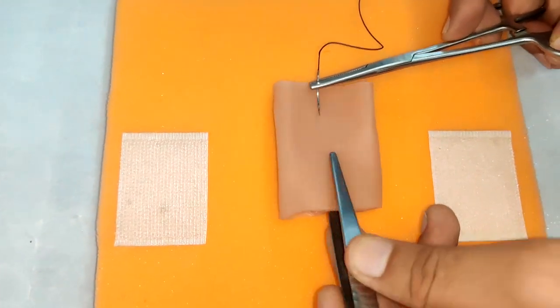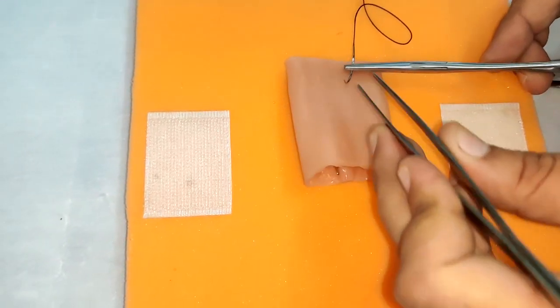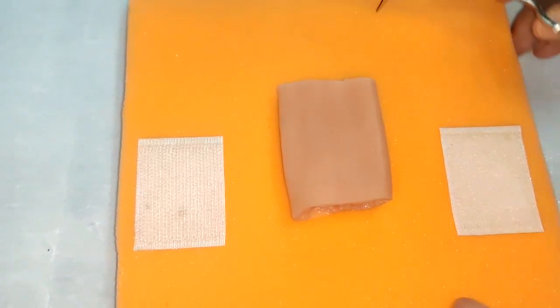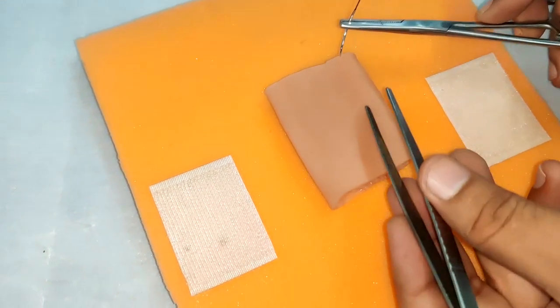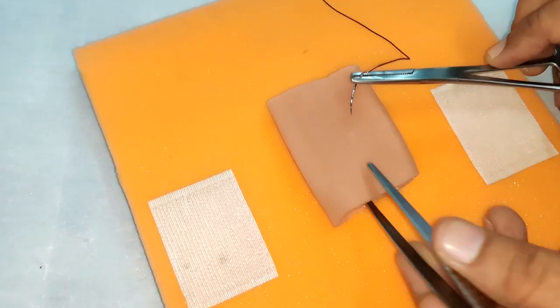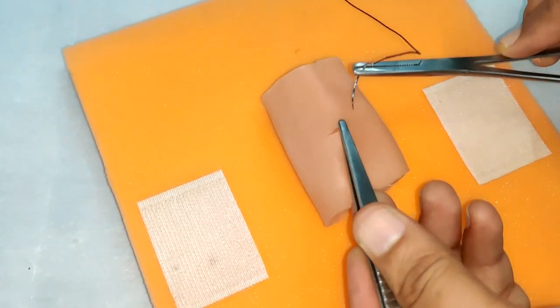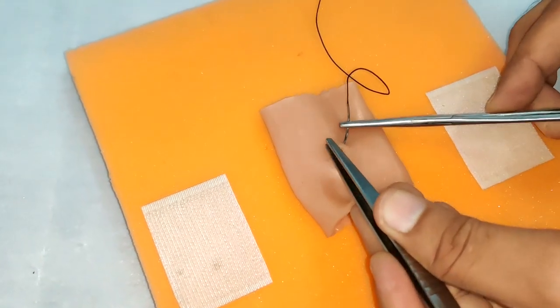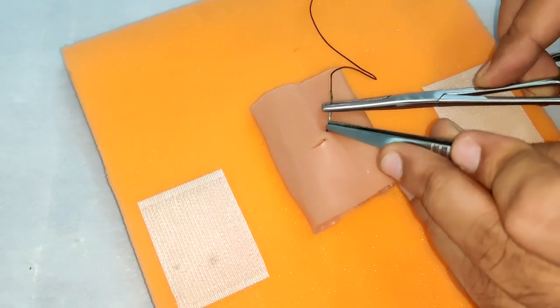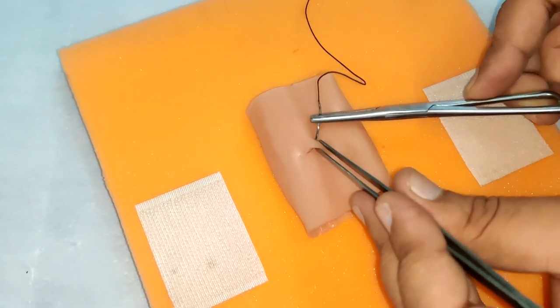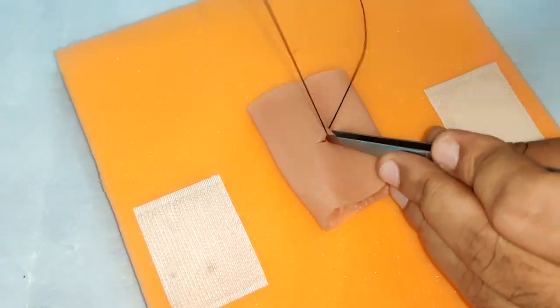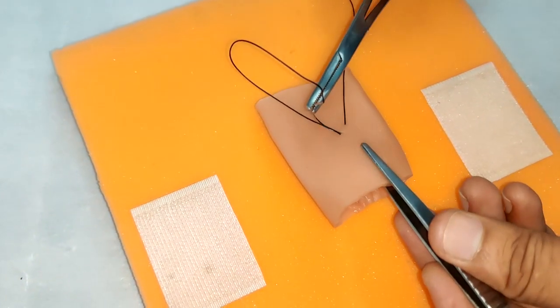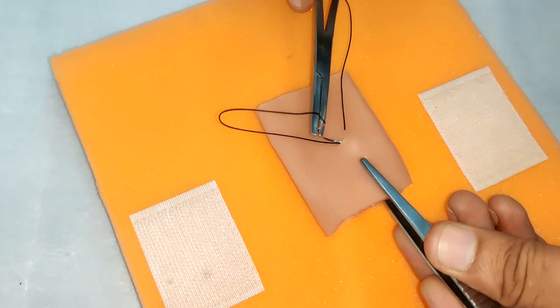The first way to suture is that we start from beyond the perforation and take simple interrupted sutures. So from beyond, we are coming inside and from inside, we are going out. And then again, from inside, we are coming out on the same level.